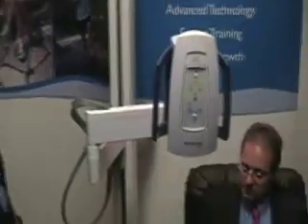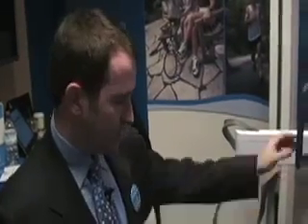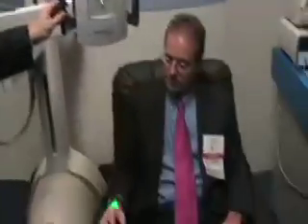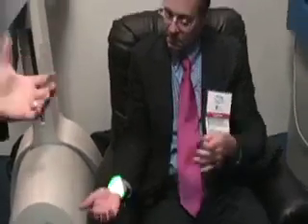It's not necessarily a diagnostic. It's more used therapeutically, quite frankly, because it's essentially image-guided surgery. Because it's off the field, it allows the surgeon to have both hands free when doing the procedures, and it can be moved very easily during the procedure to visualize some of the effects. For instance, with foam sclerotherapy, you can strongly visualize where the sclerosing agent is going in and the depth to which it penetrates.